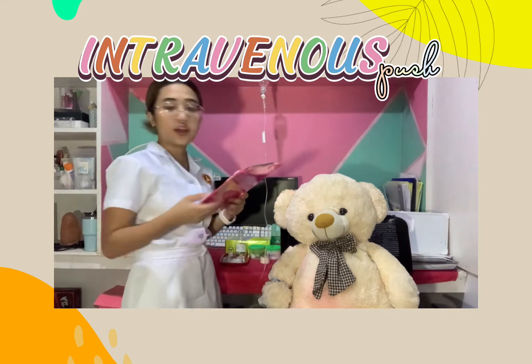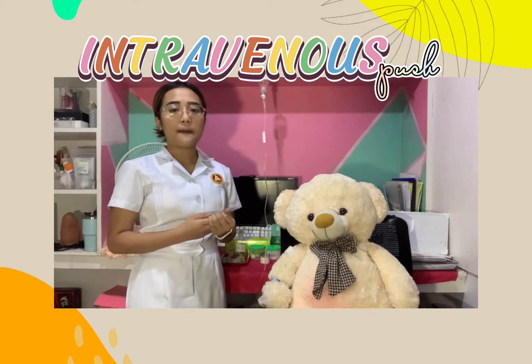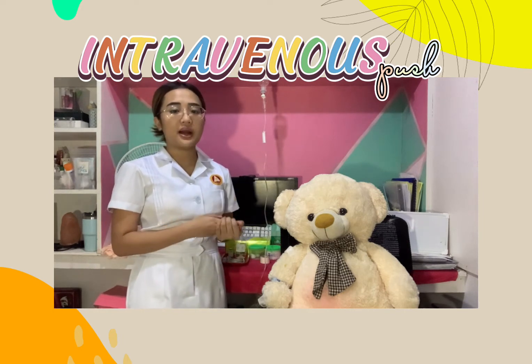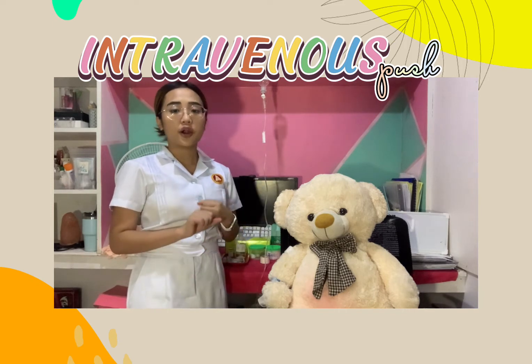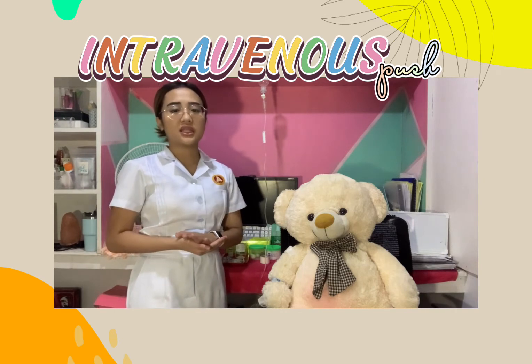After that, we need to make sure to compute or calculate the normal dosage of the drug accurately. And then we need to make sure to read the label of the drug when taken from the medication cart, before withdrawing and after withdrawing the medication. After the planning, we will now proceed to the implementation.